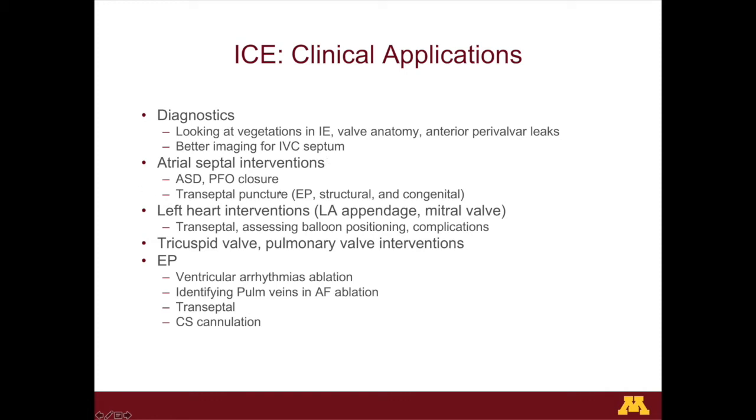The most common use of ICE, however, is in atrial septal interventions, including ASD-PFO closure and transseptal punctures. And our structural heart disease colleagues have revolutionized the use of ICE in left heart interventions, including interventions on the mitral and the left atrial appendage. It is extremely useful not just in helping with transseptal puncture part of the procedure, but also in assessing balloon positioning or device positioning and looking for complications such as pericardial effusion and MR, etc.